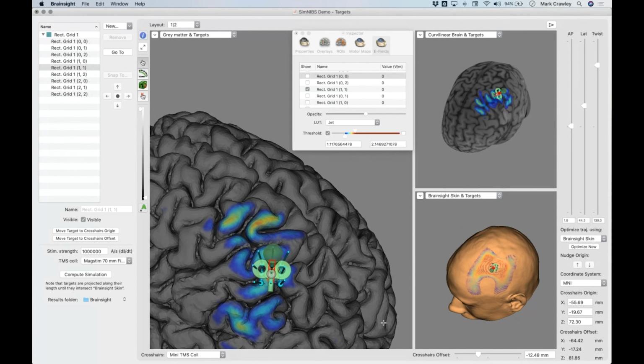Yeah. So Brainsight is only written for Mac. As long as you've got something with a lot of processing power, so we all use MacBook Pros, or an iMac with a good amount of processing power, and at least macOS, I believe Catalina is the oldest one.